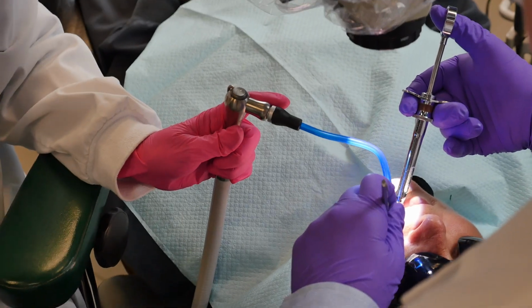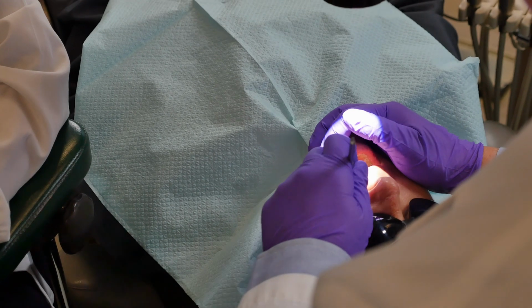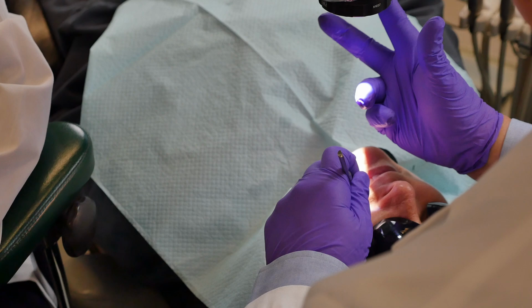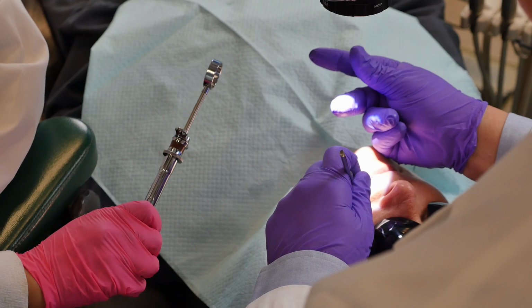And then when you actually take the video apart and study it with your assistant, for example, here you can see that we've made some errors in the syringe pass, and you don't uncover these errors unless you actually study the video. So in slow motion, there's the invitation for the syringe. Here the syringe comes over.